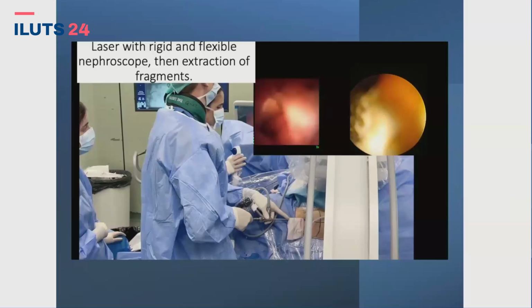A guide wire should pass smoothly, and dilation should never be performed unless you are really an expert and know what to do. And what you did is brilliant. Stay a little bit away. So don't go too far in depth, in order to make sure urine comes out. Otherwise, you will tear all the parenchyma, all the infundibuli. So it's great, but because we are an expert.